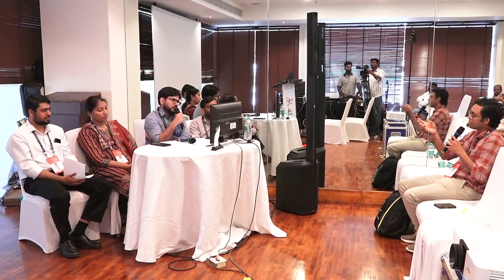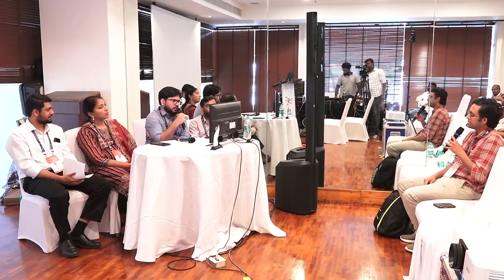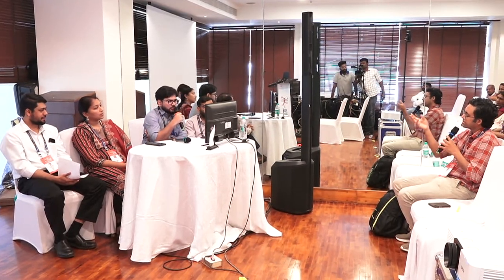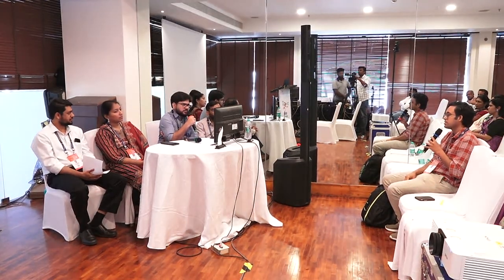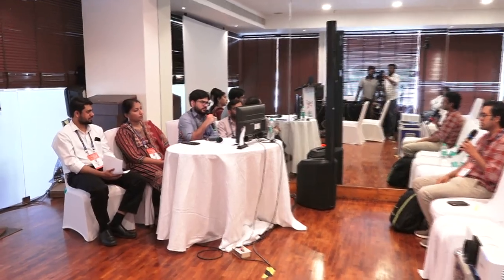So you rely more on the GCC or on the RNFL when it comes to IIH? I will look at both of them. Both are very important. And if it is, say, a pituitary adenoma or a craniopharyngioma compressing the optic chiasm, which would you prefer more? Again, ganglion cell layer thickness will be better because it predicts visual acuity and visual fields better than the RNFL.